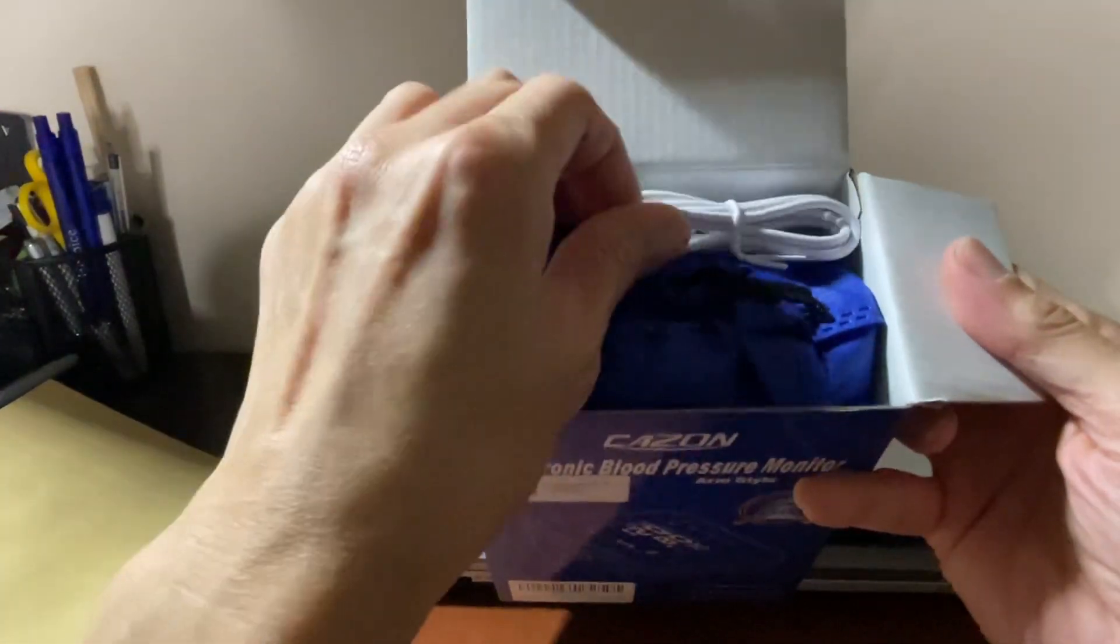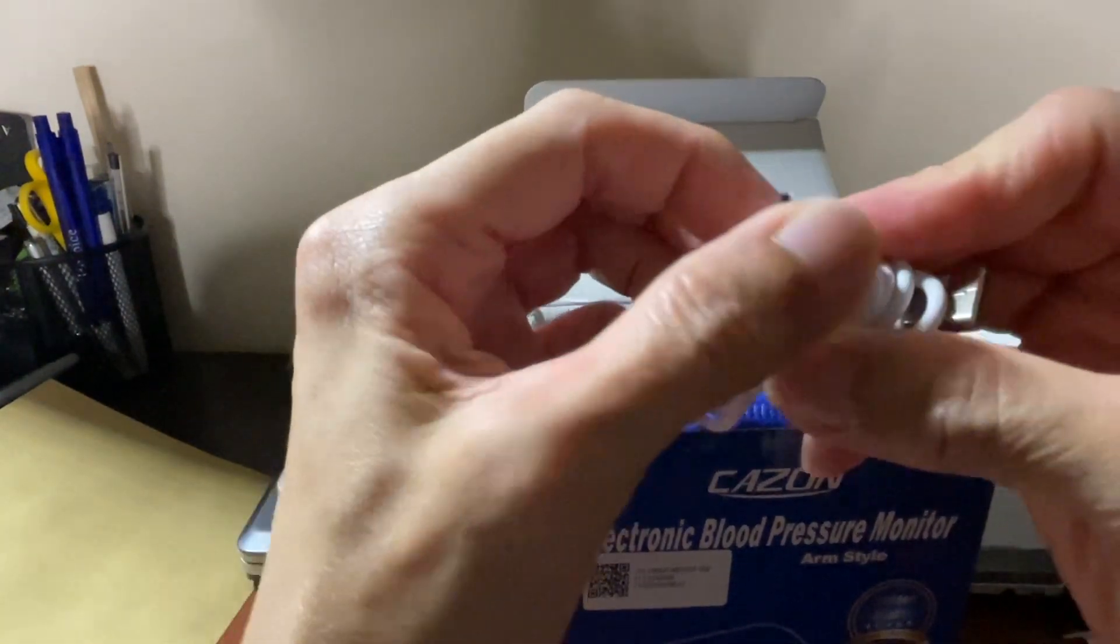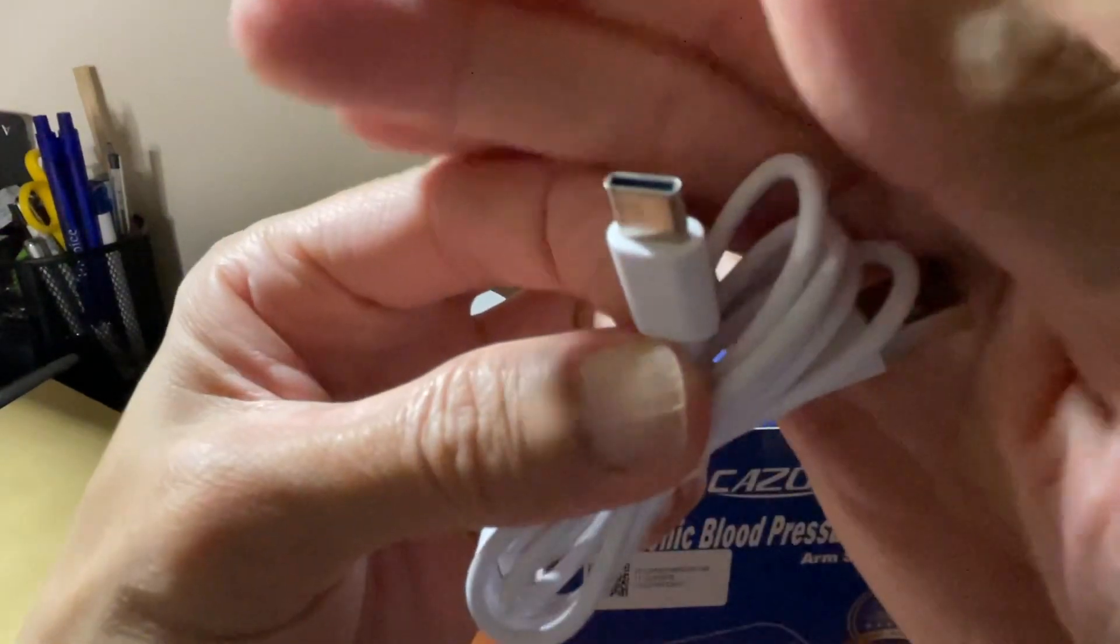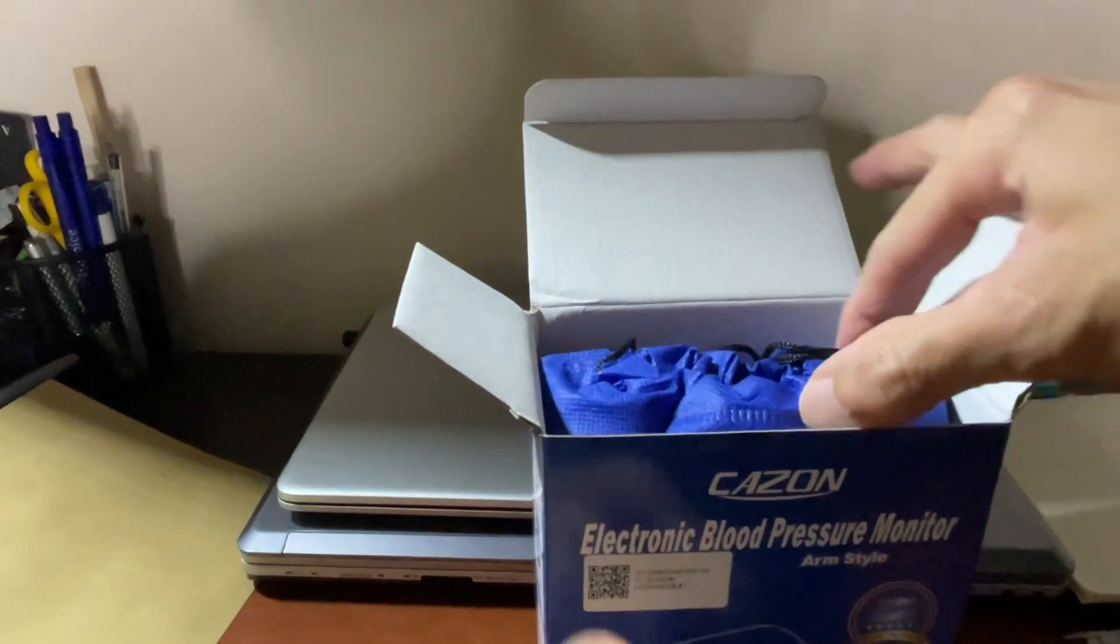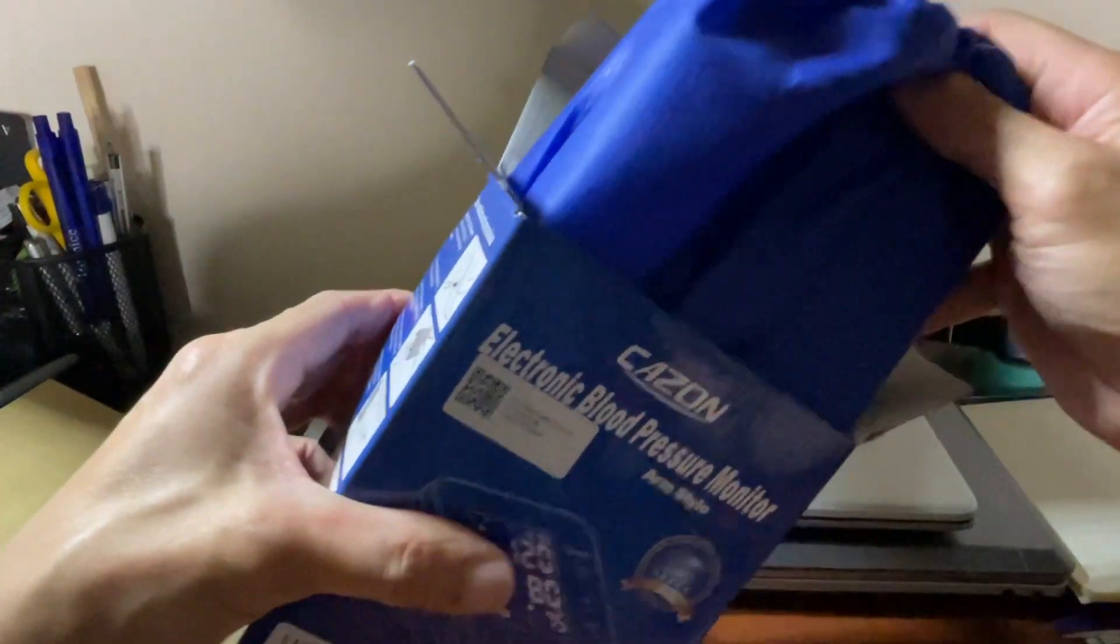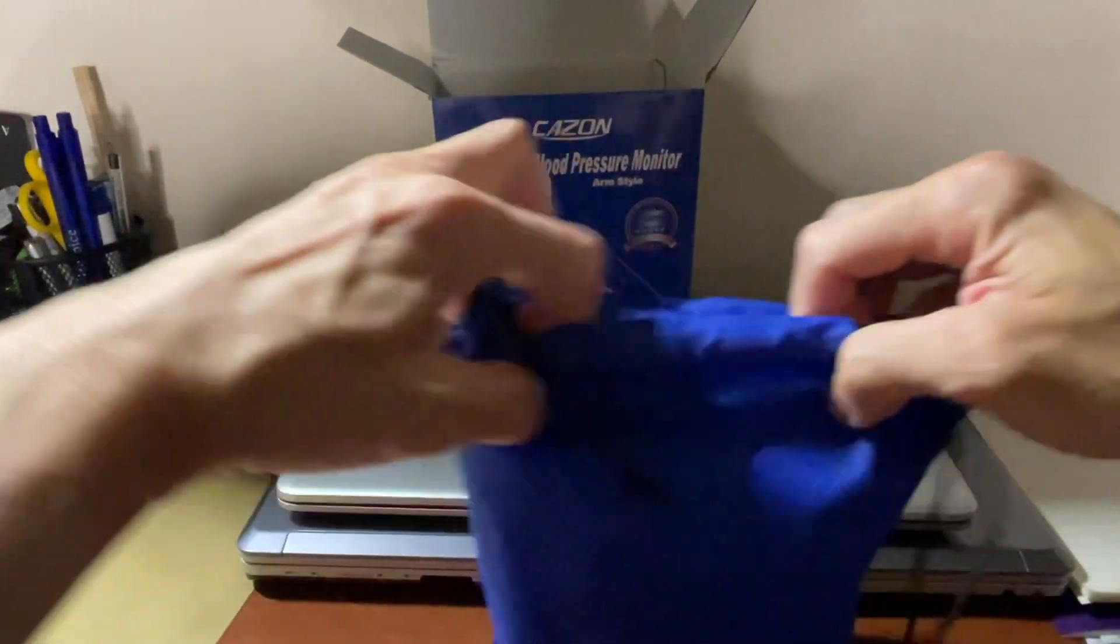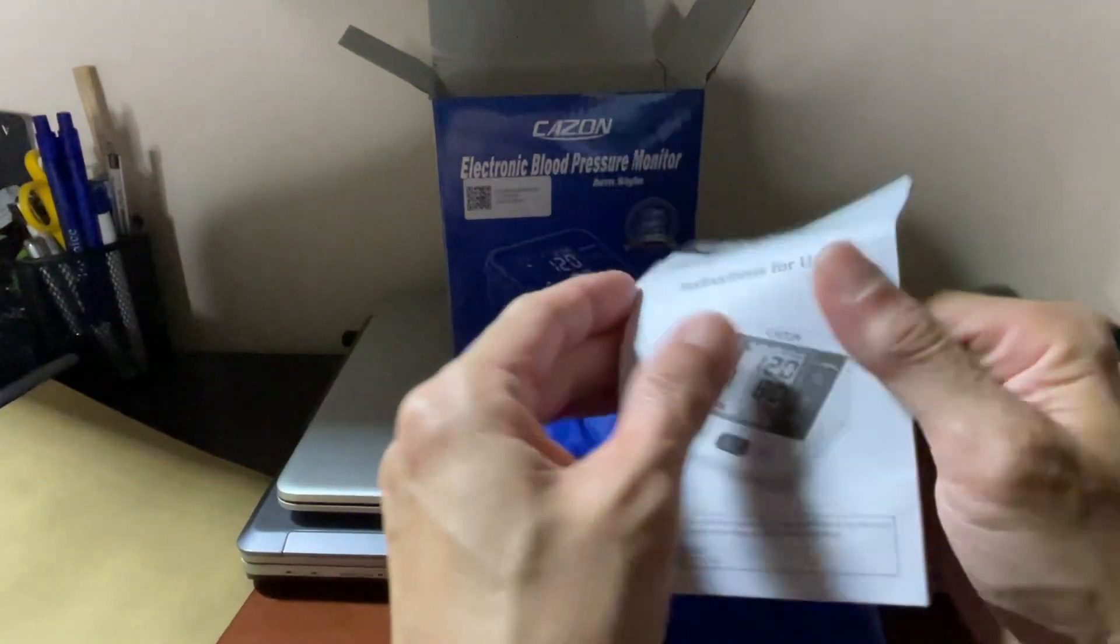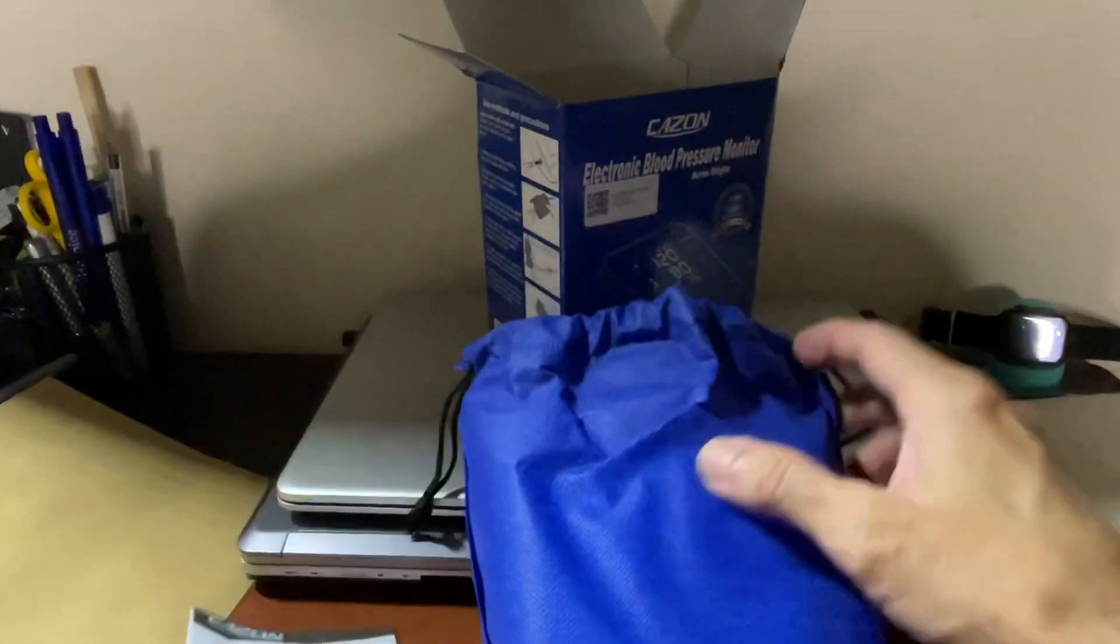It comes with the USB cable as a type C. As you can see, it comes with a bag also, a pouch bag and instruction. What else?